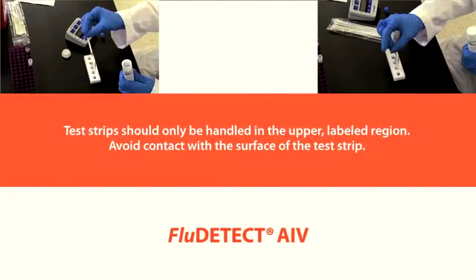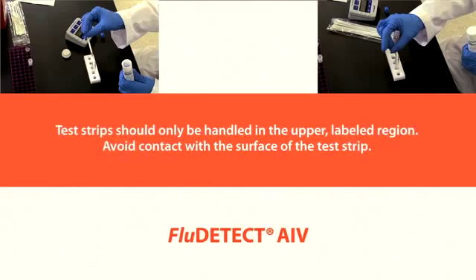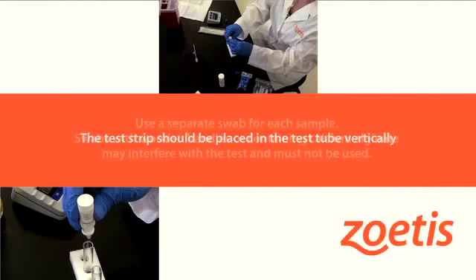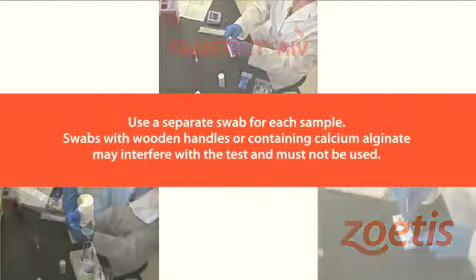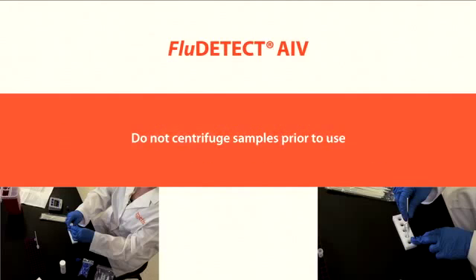The test strip should only be handled in the upper, labeled region. Avoid contact with the surface of the test strip. The test strip should be placed in the test tube vertically. Use a separate swab for each sample. Swabs with wooden handles or swabs containing calcium alginate may interfere with the test and must not be used. Do not centrifuge samples prior to use.